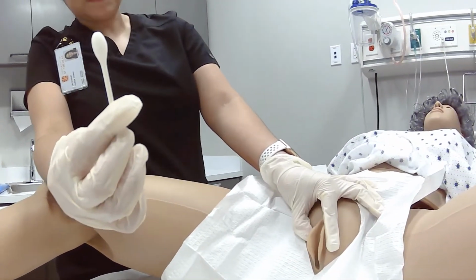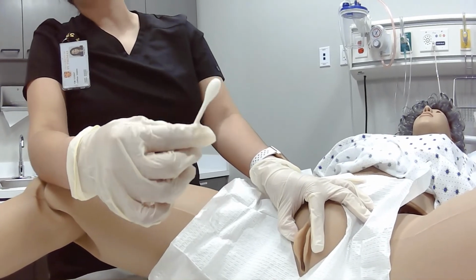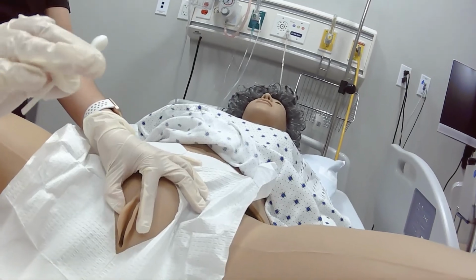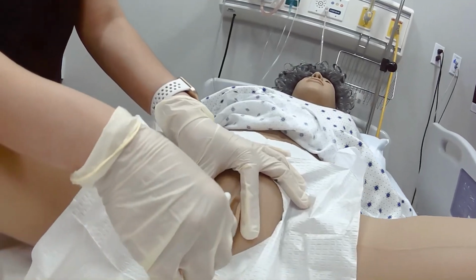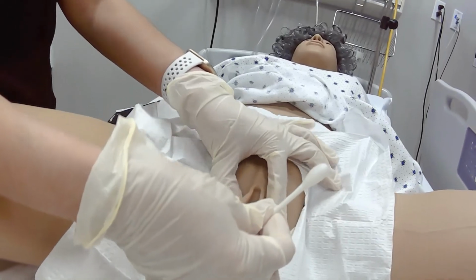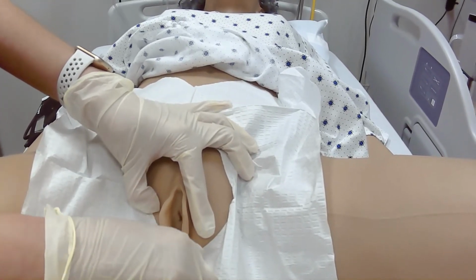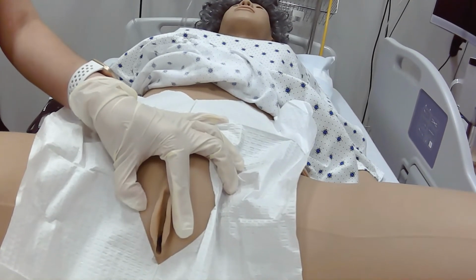And then here's our third one. Now with this third cleansing, this third swab stick, you're going to be able to identify the urethra because you're going to see a wink. You're going to see like a little pop, kind of like when a bubble bursts, it kind of shimmers, it shines. That's what it looks like. Because in some women or some females, it'll be difficult to see that urethra, especially the elderly. So for this last one, we're going to clean top to bottom, one wipe, and then we should see that little blip, which is the wink.